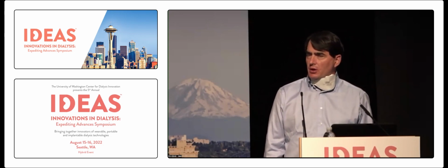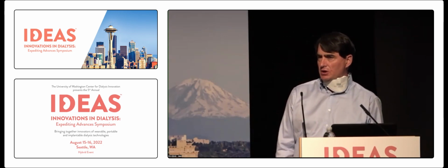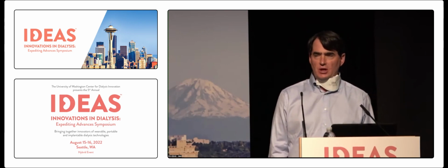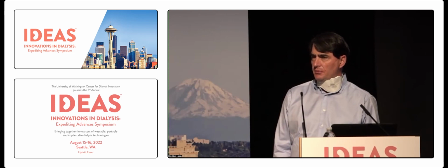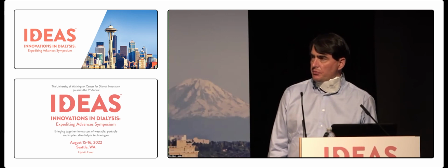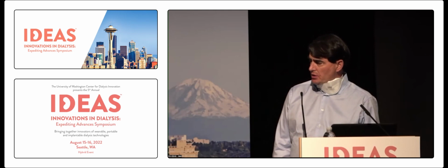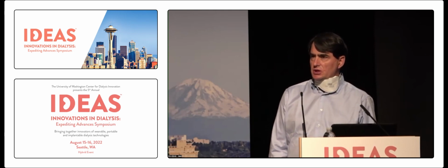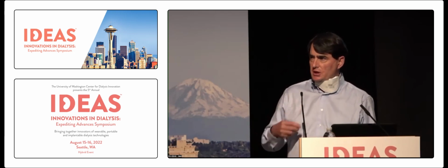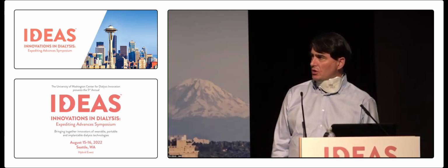We would like to think about life cycle management in the same paradigm as, for example, pacemakers and AICDs. There are aspects of an implanted device that are incredibly hard on the patient, and vascular access would be high up on that list. Like with the pacemaker's lead insertion, it's the kind of thing that you get to do once. The pacemaker generator exchange is a minor outpatient procedure nowadays. It's located in an easy-to-reach subcutaneous pocket. Quick connect, disconnect, close the pocket, and you go on your way.